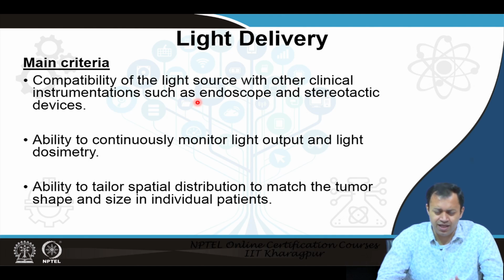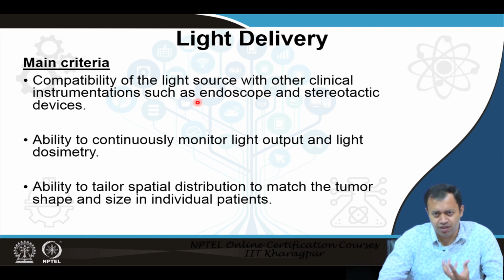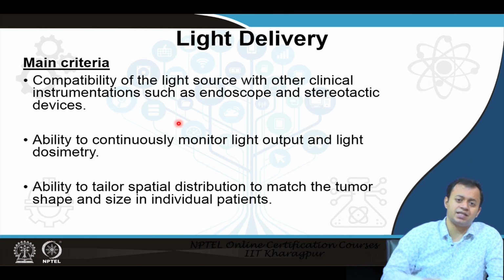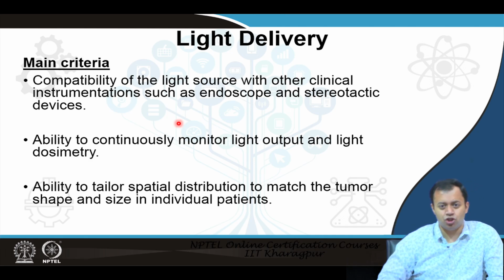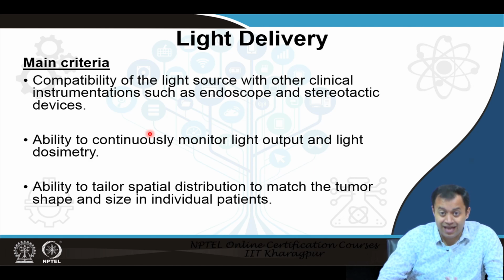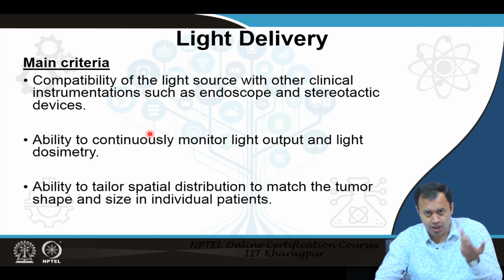You are sending a bunch of light and collecting a bunch of light, and thereby continuously not only seeing, but understanding the chemistry change. Some of the light that gets scattered will carry the information of the molecules that it has scattered from, the molecules that it has vibrated, and thereby we can understand the physics change as well as the chemistry change. Hopefully nothing else has come up because of the burning.